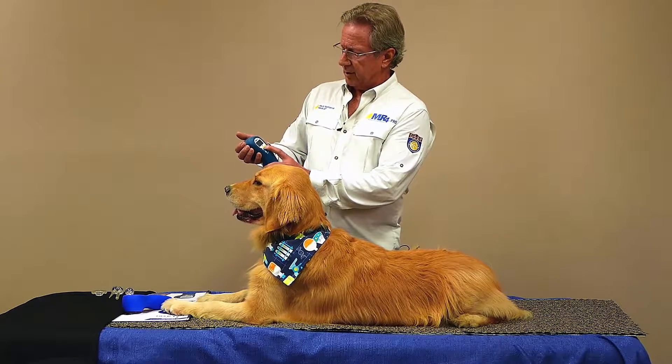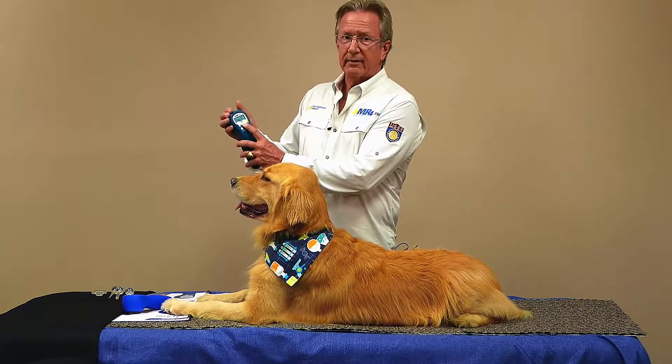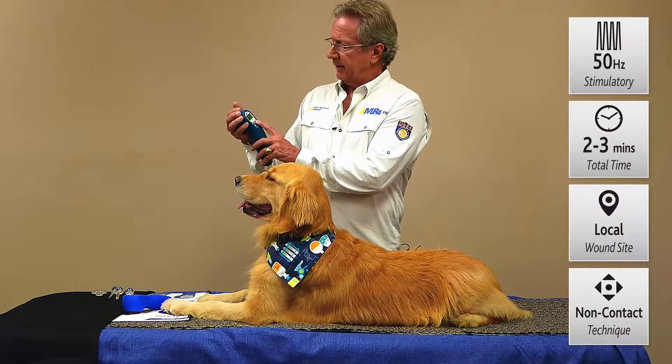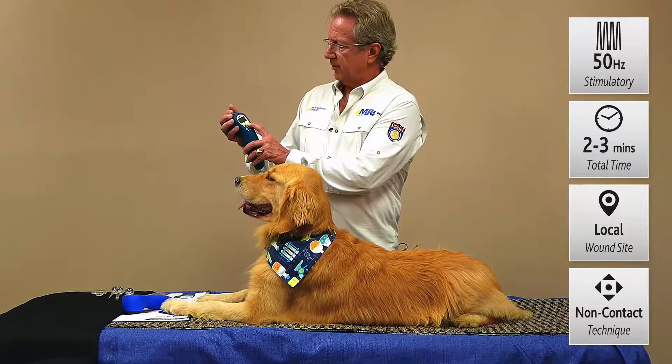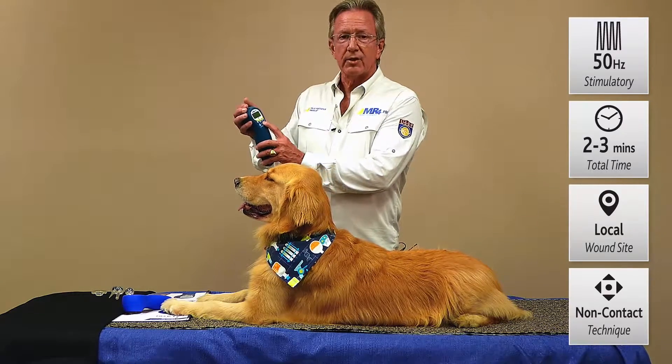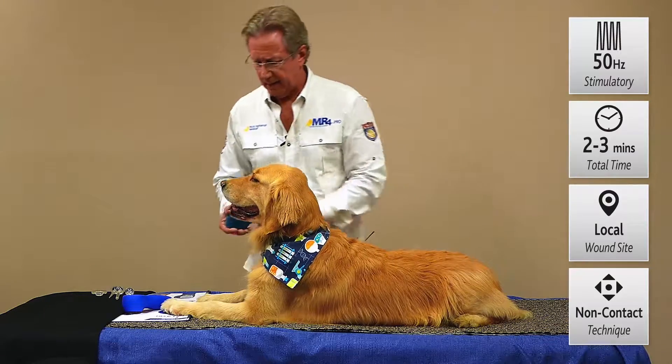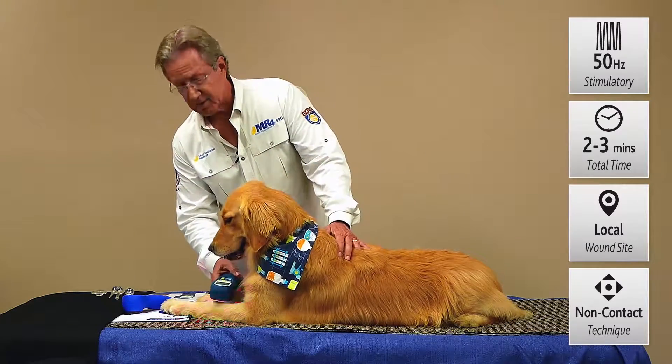So we'll change this to 50 Hz. We press the Activette Pro setting and it defaults to 50 Hz. Just press select, and then we'll set the timer up to 10 minutes so we have plenty of time to work with it. Hit start. We've now provided inhibitory relief along the spine and we can come along this wound site and stimulate.